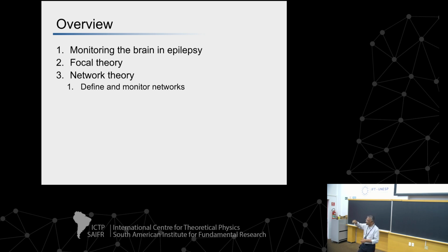It's almost like you've gone in and opened the hood of the car and you're looking at it. You don't have a manual. You don't know what you're looking at. It's complicated. Of course, we knew it was going to be complicated, but it's fascinating. Those signals are fascinating. You might want to look up groups like Kathy Chavon's from NYU, from Columbia, where she's looked at Utah electrode arrays and seizure recordings. There are descriptions, not just from her but from others active in this area, of microseizures. At the microwire recording level, you get tiny seizures that don't coalesce into larger events. The macro contact sitting next to it doesn't see it, but that contact sees these tiny seizures, which we don't know how to understand. It's like we're looking under the hood, and it's fascinating, but we're still waiting for someone to give us insight as to how to proceed.